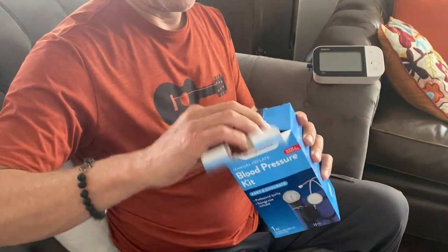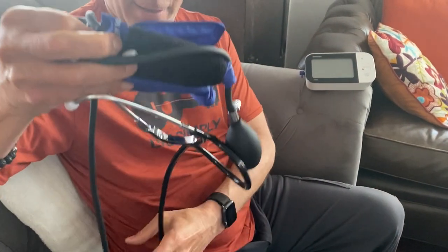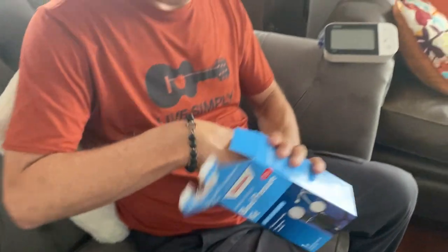This is one of the manual kits. It comes with a blood pressure cuff, a gauge, a bulb, and a stethoscope. You can put the stethoscope aside — you won't need to use it.